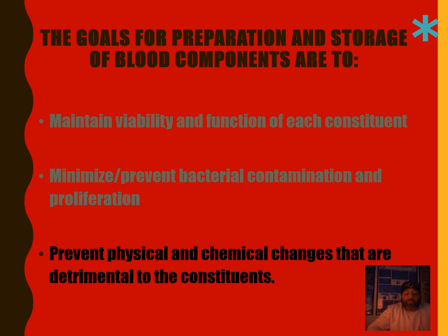for donation, for issuing to particular patients with particular conditions, the red cells themselves can be sensitive to particular changes. So, for example, as I mentioned in the first presentation around this particular episode about hemostasis, generally red blood cells, like other blood cell components, can be sensitive to things like temperature and changes in conditions under storage as well. So generally, these things are important as an overview.